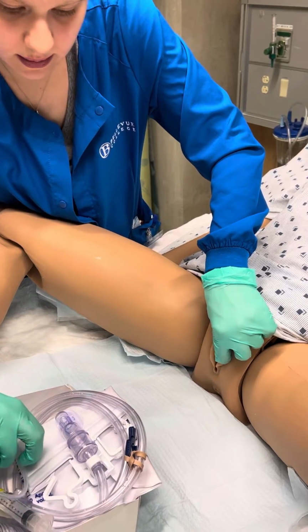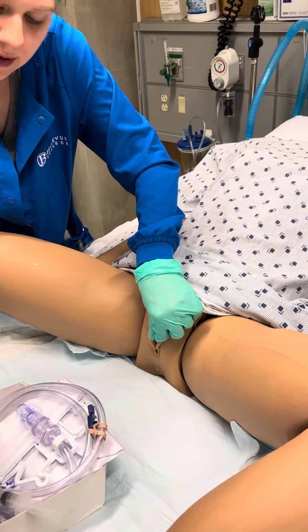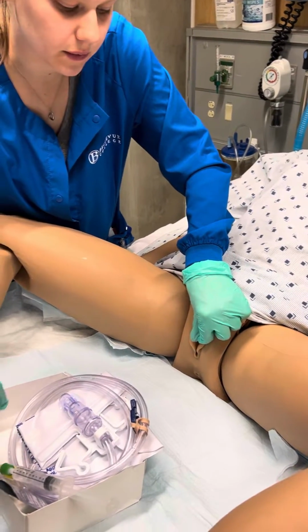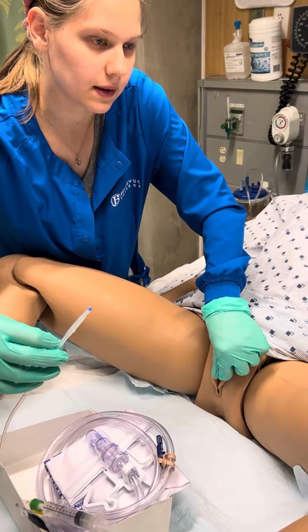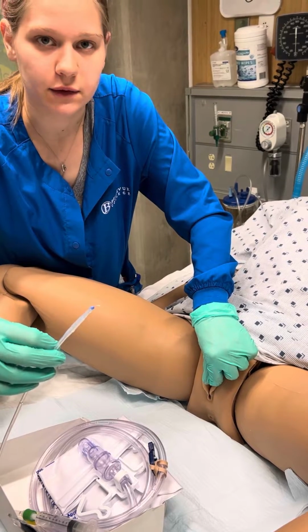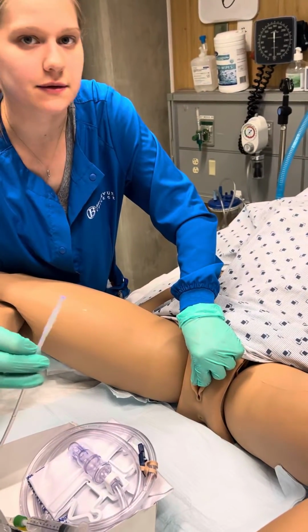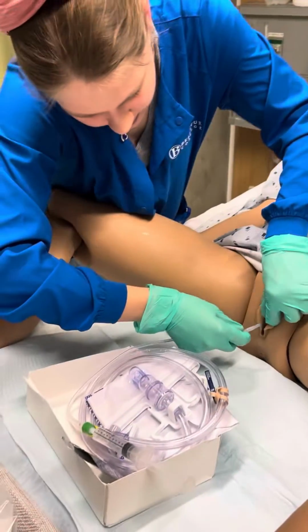Okay. And then I would dip the tip of the catheter into the lubricant and also lubricate the urethral meatus. If it were a male, I would do the lidocaine. If it was ordered, I would insert lidocaine into the urethral meatus of the penis. But we're not going to do that here, because our patient is a female.